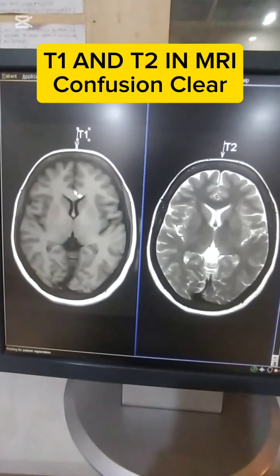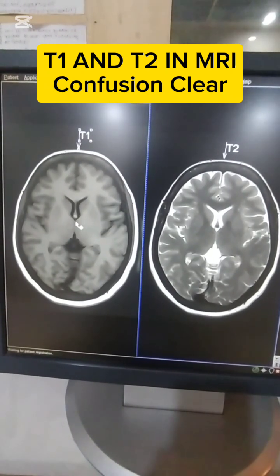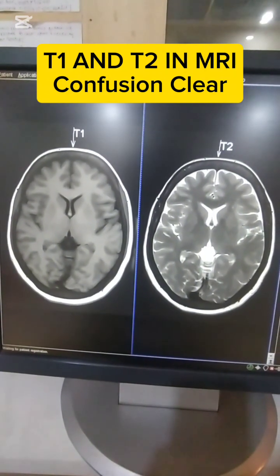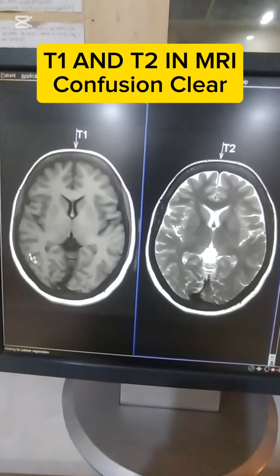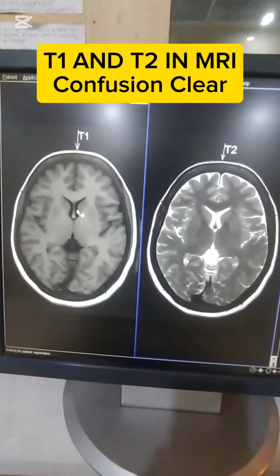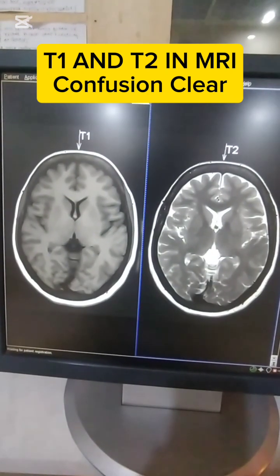Because the T1 timings are used in this protocol, and in this T2 protocol, the T2 timings of the tissues are used to create this T2 image. In these two images, look at the CSF: in T1 weighted the CSF is dark, and in T2 weighted the CSF is bright.